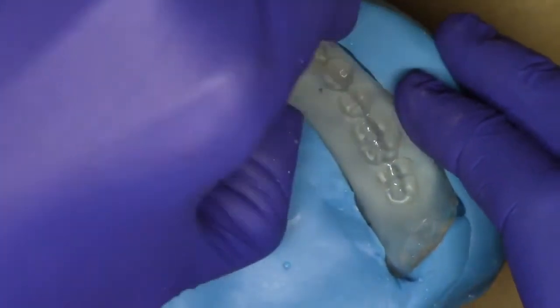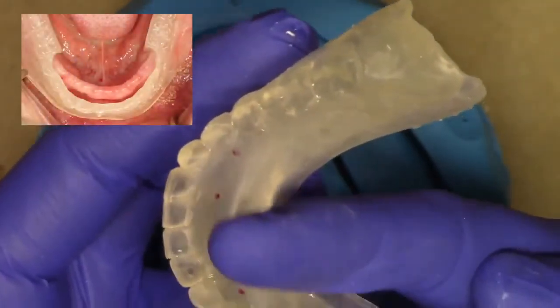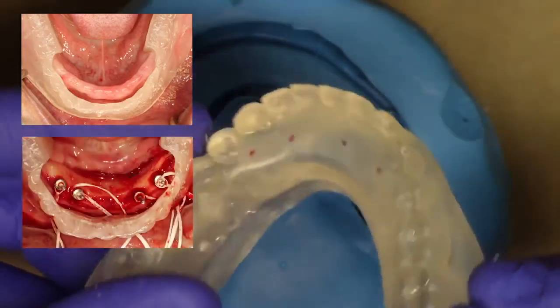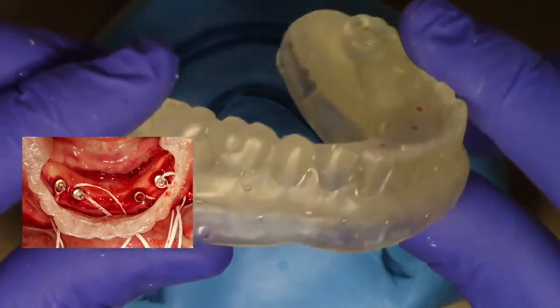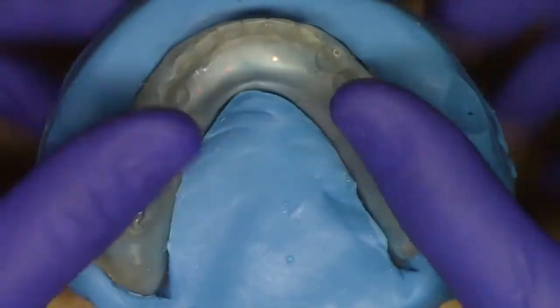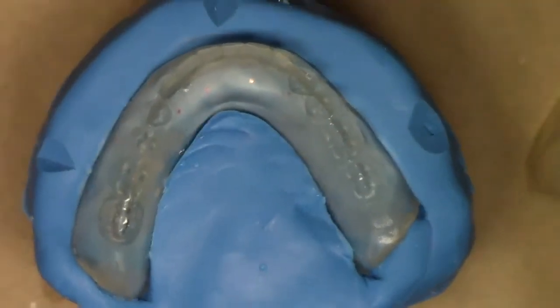But nonetheless, what you can always do is cut a trough on the lingual portion of this surgical guide, like what you see in the picture in front of you, and that can always give you the assessment of where the relative tooth positions are. This is very, very critical for proper LODI placement because knowing where your prosthetic position is going to be makes your surgical procedure that much easier.